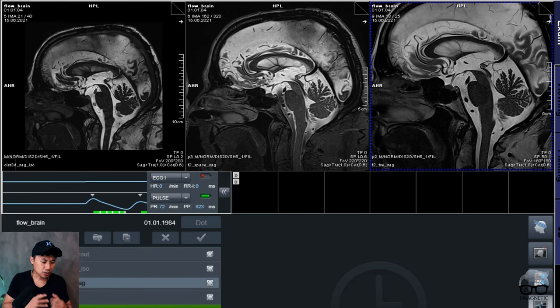Okay, let's go back to why we did the static image, the three images I did, the CISS, the T2 SPACE, the T2 weighted 2D. So at our workplace, like I mentioned before, we usually only do the static part, the quantification is more for studies. Nevertheless, we do a CISS because we get thin slices, we get good contrast between the fluid and the surrounding tissues, and we're able to look at the ventricle very clearly. And you see here, it looks clear there, and you also have the possibility to do thin MPRs in multiple planes. And then we're using our 3D SPACE, a T2 weighted, exactly for this purpose.